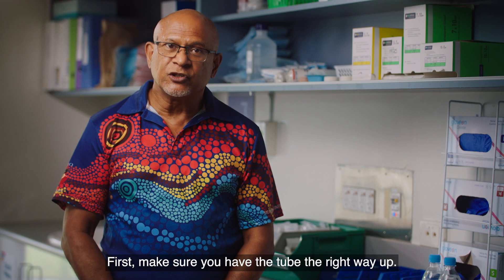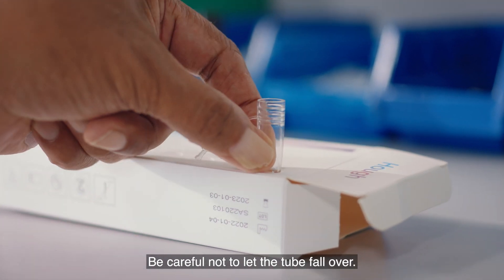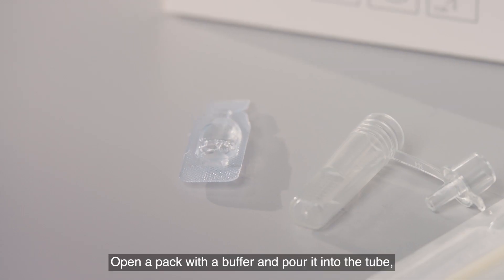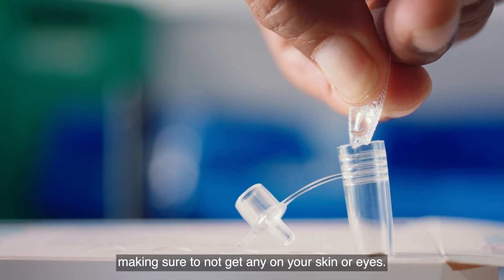First, make sure you have the tube the right way up. Your test kit might come with a stand to help. Be careful not to let the tube fall over. Open the pack with the buffer and pour it into the tube, making sure not to get any on your skin or eyes.